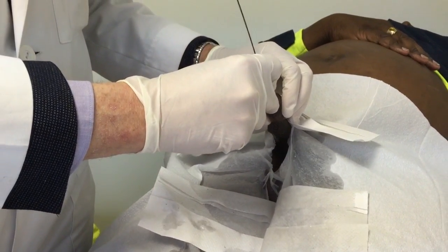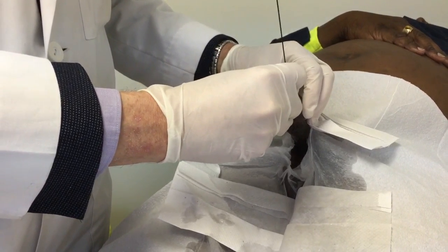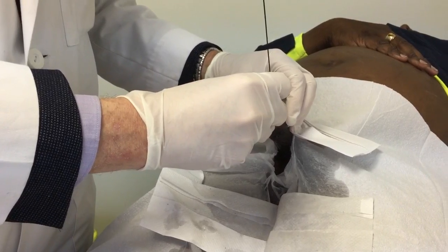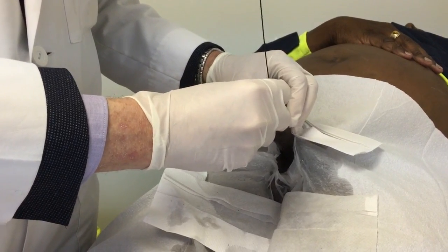I'll show you the rest of the stricture. You can feel the resistance from the stricture and actually it cutting the stricture.